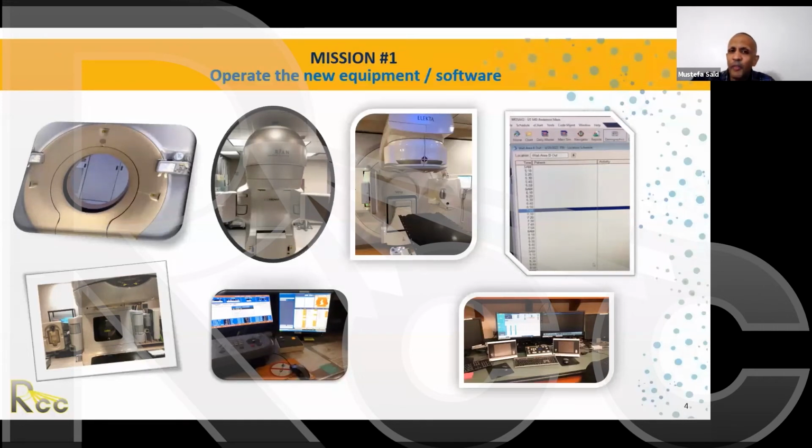One of the machines may tell you the default setting is 65 kV and 4 mAs for the lateral brain. But you could do that with the kV. Probably you could end up at 60 or 55, but the mAs could come down to 2 mAs. You could just drop it in half, and the mAs is where the dose comes from. So you could do that.